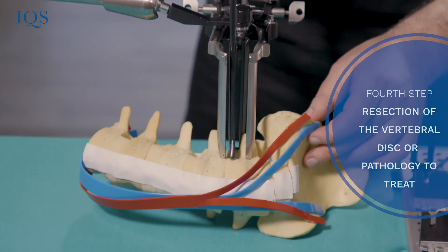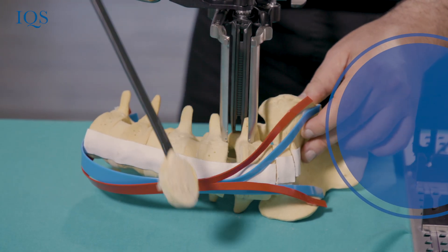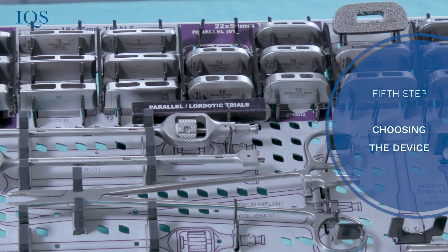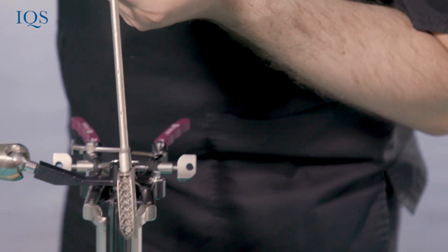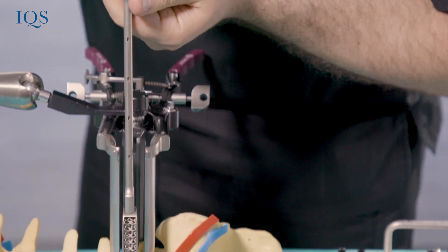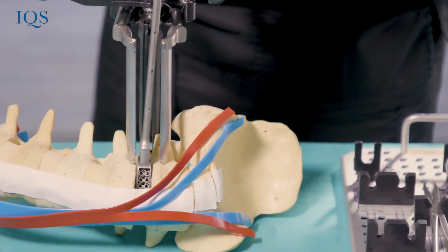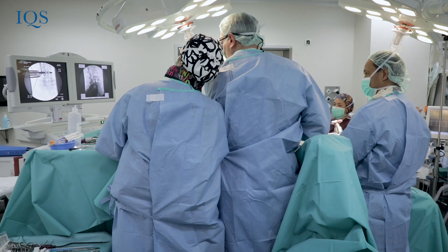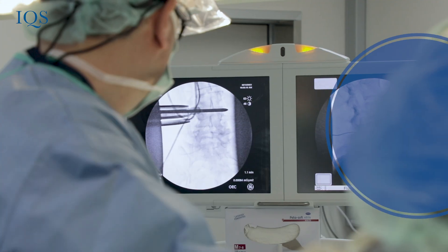Fourth step: we proceed with disc and pathology resection. Fifth step: depending on the sagittal profile of the patient, based on full-body X-ray study, the right device is selected to maintain or restore the physiological lordosis of the patient. Sixth step: the chosen device is placed.